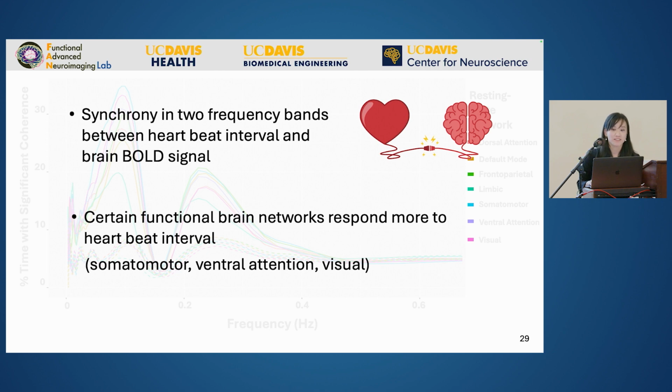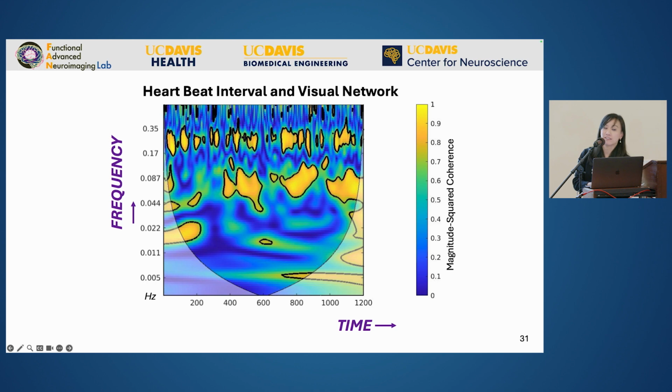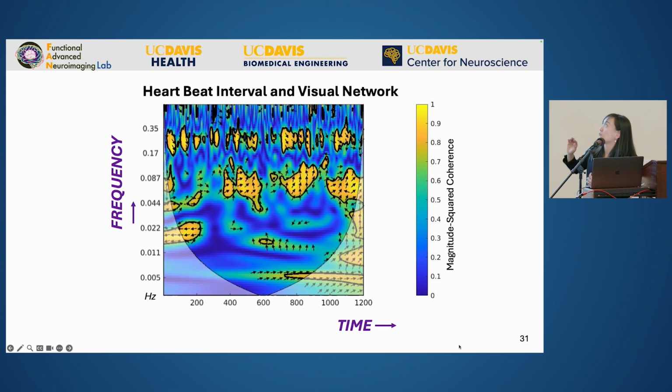The last piece of evidence I want to share from this Human Connectome Project is when we have these signals, we can not only look at if they are in sync or not, but we can look at something called phase, which is the relative lag between the two signals. So which one is coming first? And if we do that same analysis, I'm showing the same example here. From a mathematical perspective, we often will represent phase by these vectors, like how the angle of the vector looks like. And you might have to squint a little bit, but you can see the angles here are looking kind of different between the two frequency bands.